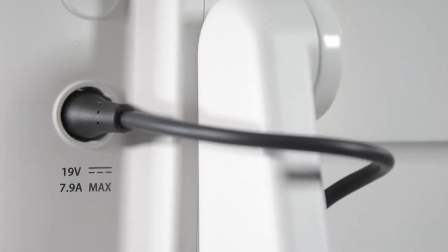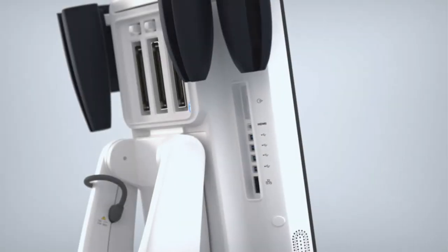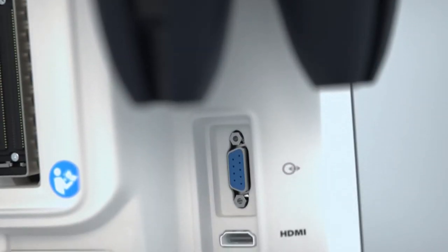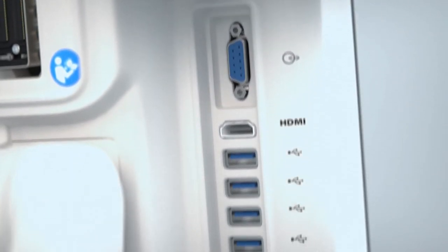On the rear of the system, there is a power cord connecting the cart to the monitor on the left above the power button. On the right, there are multiple ports from top to bottom: DVI, HDMI, four USB ports, and an Ethernet connection port.